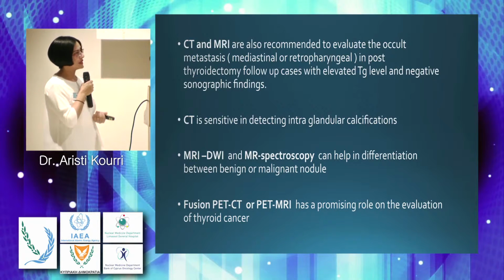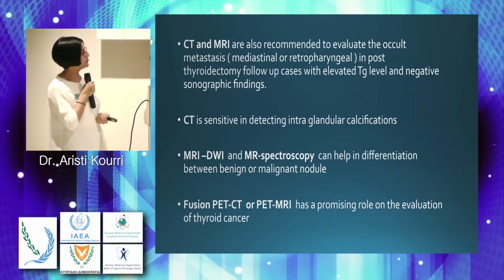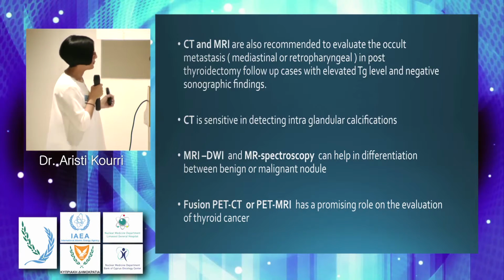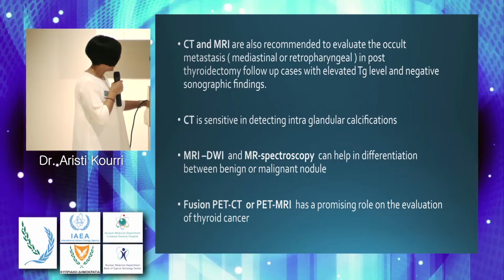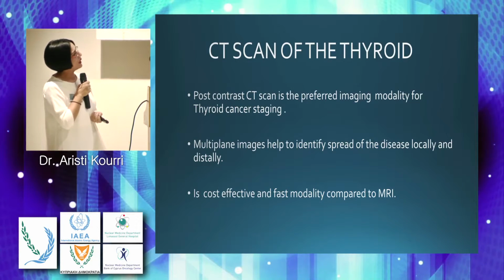CT is sensitive in detecting intraglandular calcification, something that MRI cannot do. And MRI with diffusion-weighted images and MR spectroscopy can help in differentiation between benign or malignant nodules. Fusion PET-CT and MRI have a promising role. We will hear about it from other lecturers.